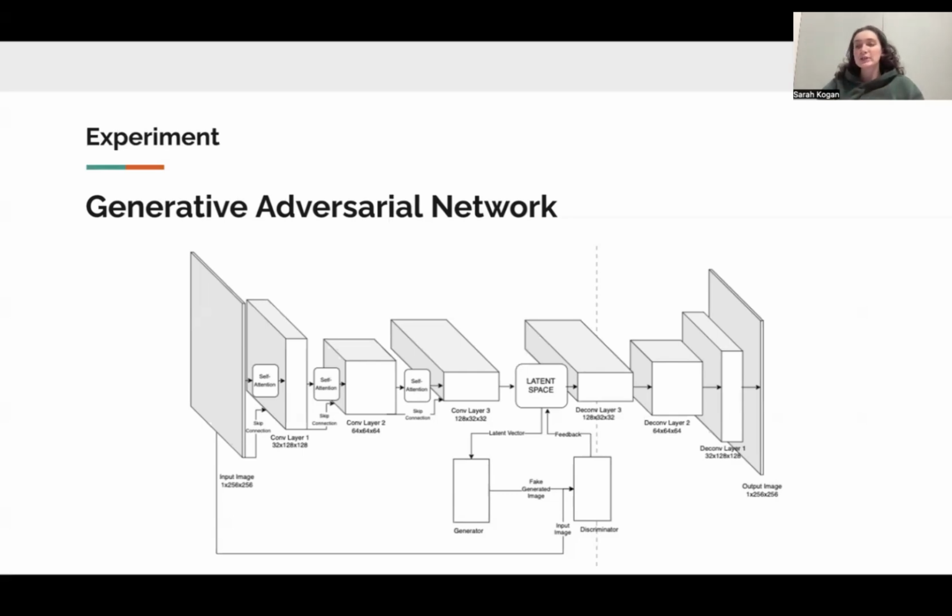So in our current architecture, the GAN is pulling a vector out of the latent space, decoding it, handing it to the discriminator, which is checking it against the input images to see if it can distinguish between them, and then returns a probability back to the latent space to continue to optimize it. Once the latent space is optimized, the images get passed to the decoder so it can generate the new data set. And the GAN optimizes using a combination of adversarial and VAE loss.